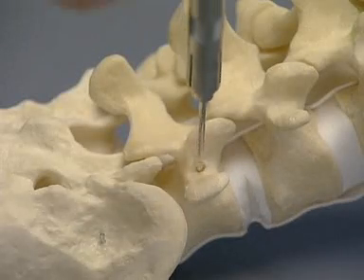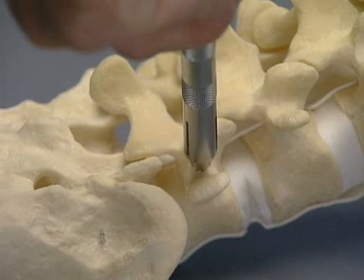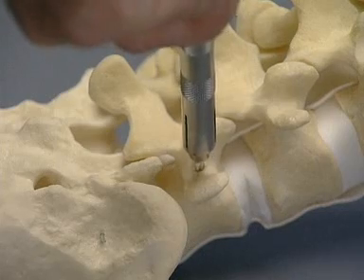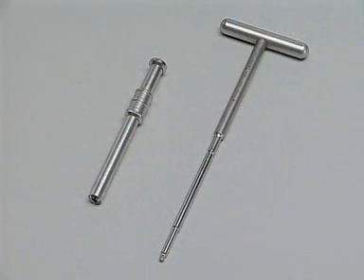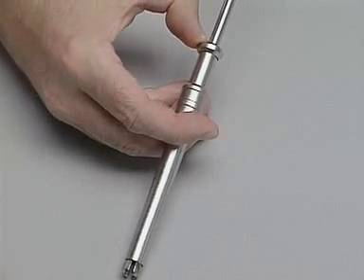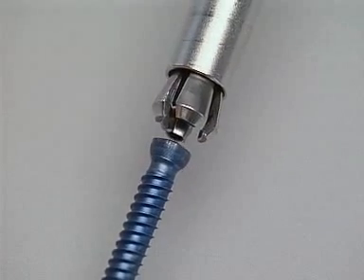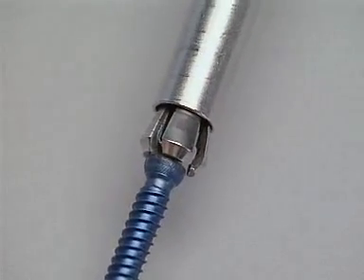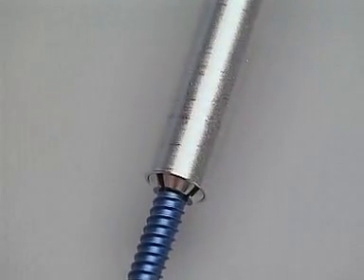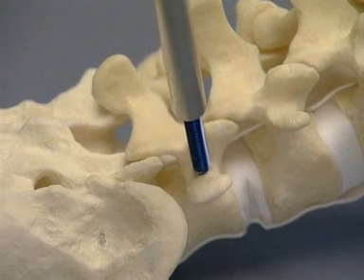The depth of the pedicle is measured, ensuring at the same time that bone surrounds the pedicle hole. A screw of the appropriate length is inserted using the T-handled hexagonal screwdriver and the holding sleeve.